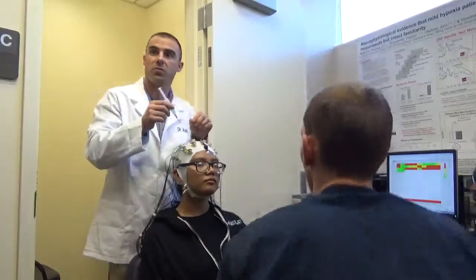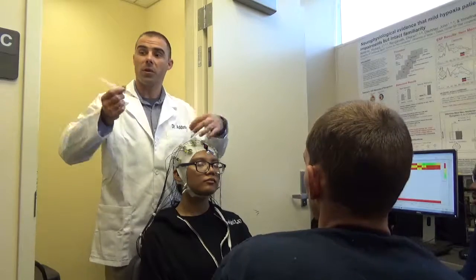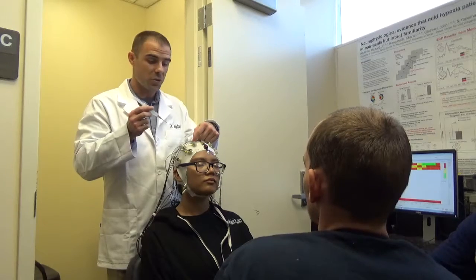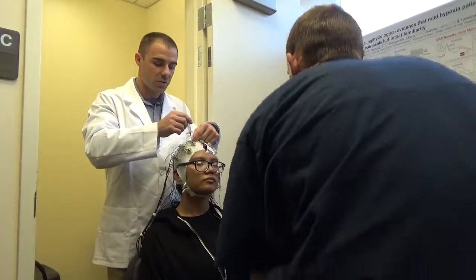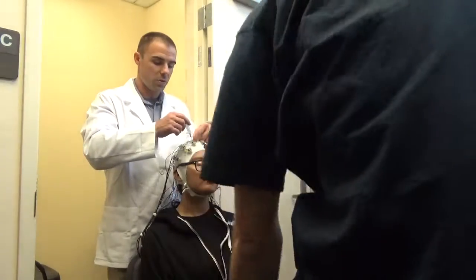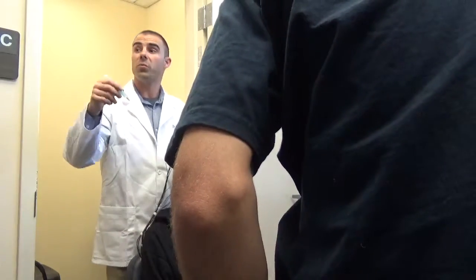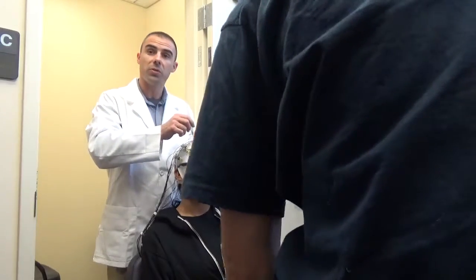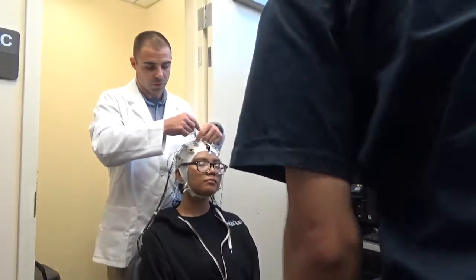Now when I work this electrode to try to get the impedance down, again, it's kind of a two-handed technique. Since I'm right-handed, I like to use my left hand to hold it in place, because you want to keep that gel down towards the scalp. Then you fit the syringe in through that little hole and start moving it. You're not going to have the space to move or rotate around a lot the way we did when we didn't have the electrodes in there, but you can still do it. Oh, see how I just turned green? Can you feel that? Does it hurt? No. Okay.